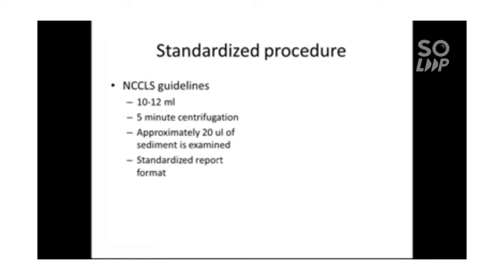It is a standardized procedure, and we use NCCLS guidelines, which include, in the exam, 10 to 12 milliliters of urine, a 5-minute centrifuge, approximately 20 microliters of sediment is examined, and a standardized report format is used.